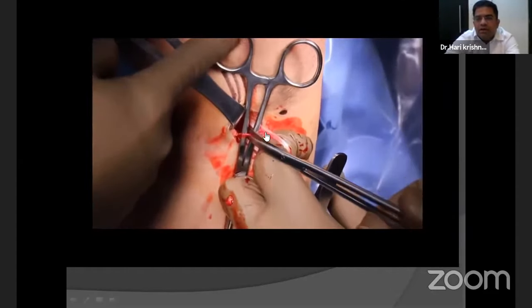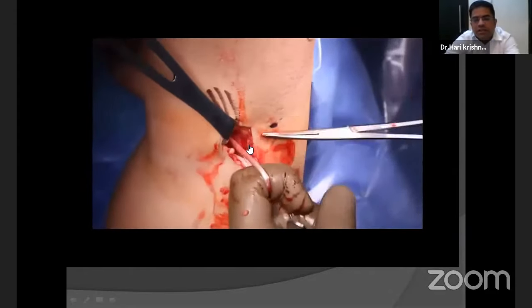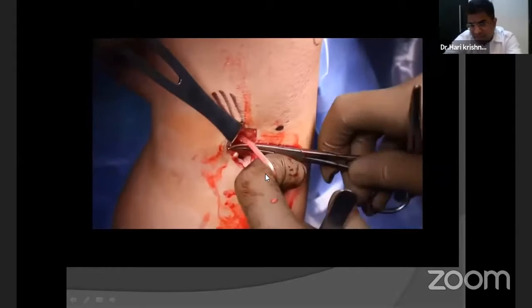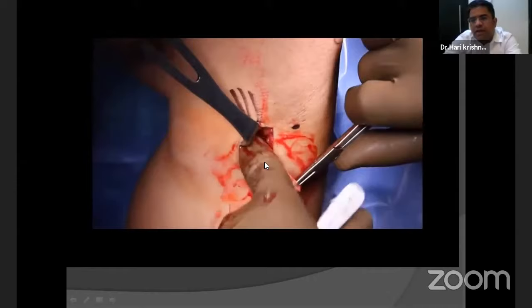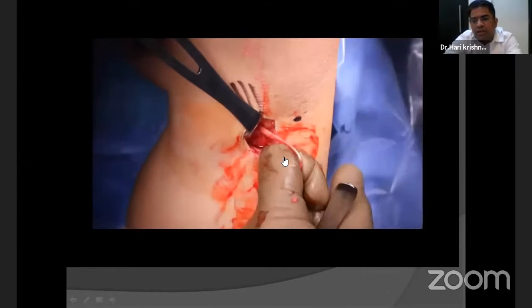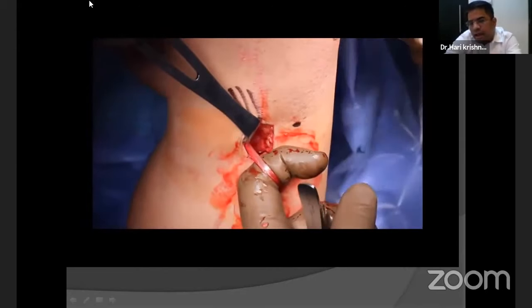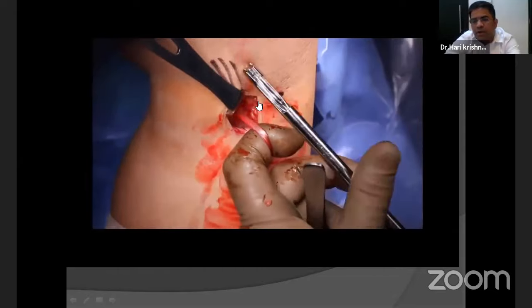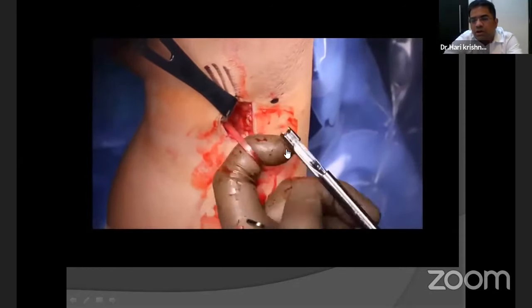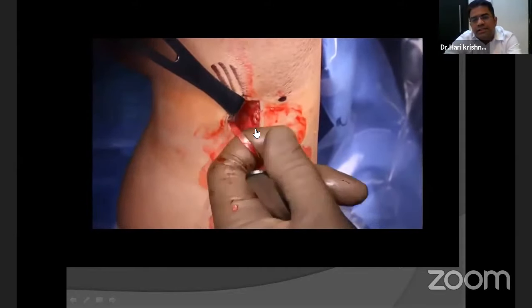And this is one more stripper, which is an open stripper. Here we remove the extra bands which were for the gracilis tendon. Here the distal stump of the gracilis tendon is not removed, so we can use an open stripper. If I have an open slot, I can pass through the tendon and go up to the distal part, proximal part of the tendon, and remove it. So this is an open slot, and I'm passing through the gracilis.